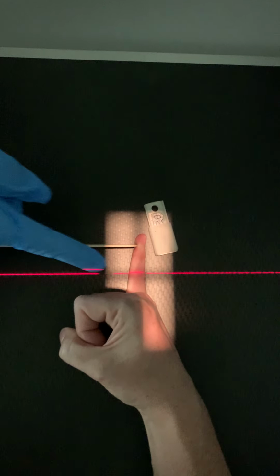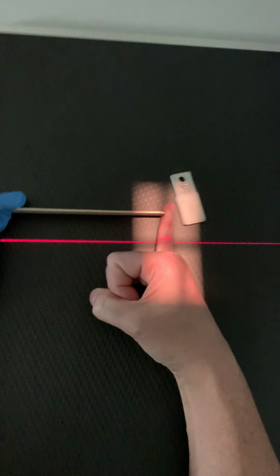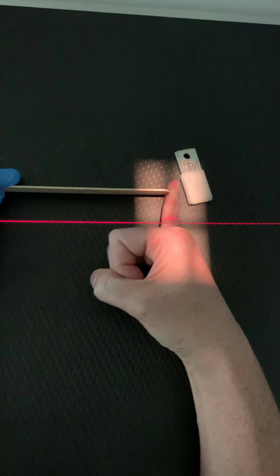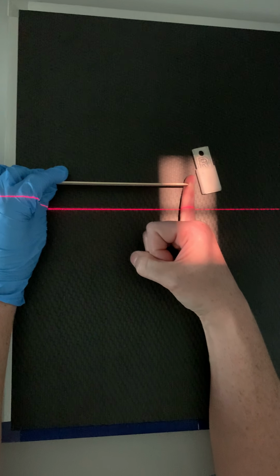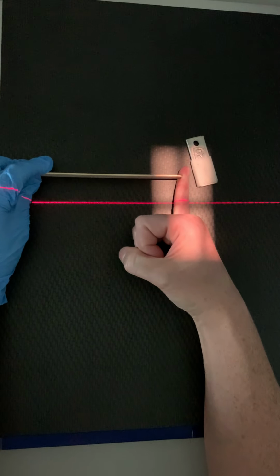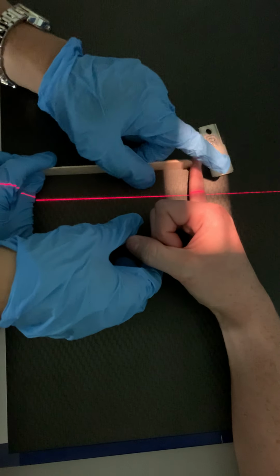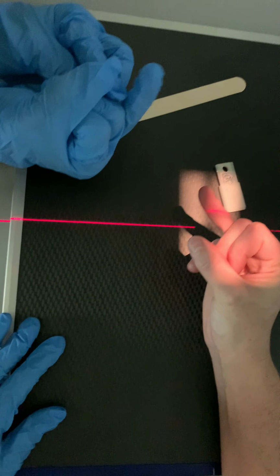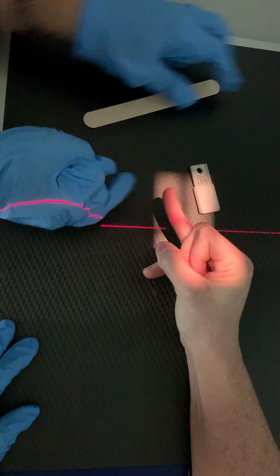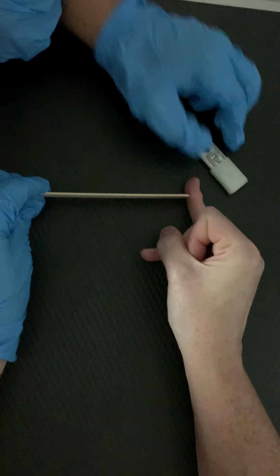Now, what that tongue depressor does is it pushes it out so we can get closer into the joint at the metacarpophalangeal joint. Makes it a little easier for us to see it. So it takes the finger and just pushes it back. Lateral 5th, okay? Lateral 4th, so what we're gonna get you to do is I want you to take your thumb and hold your fingers down if you can, like that. Take this hand, use the tongue depressor, and push that finger back.